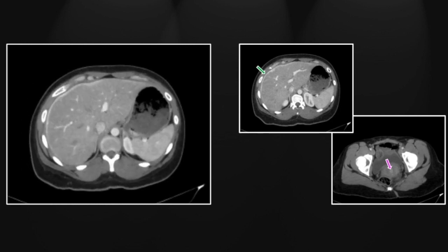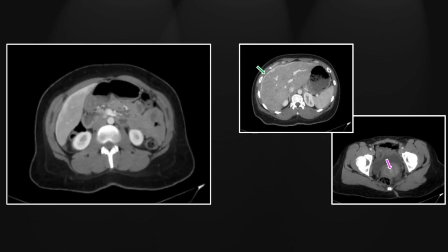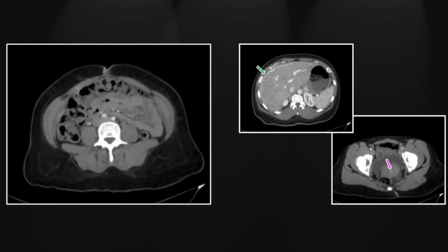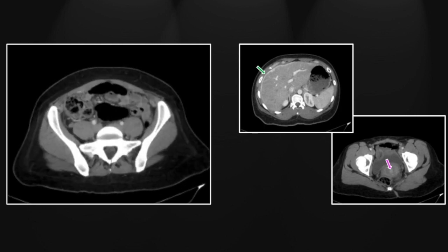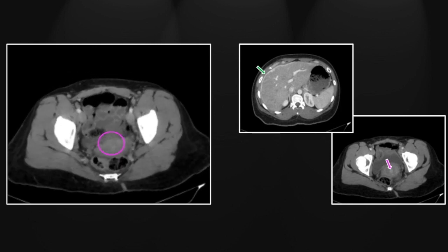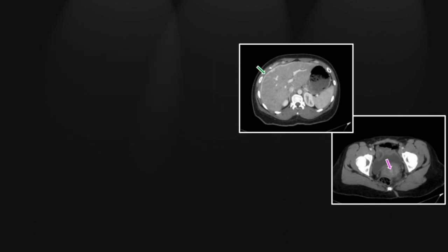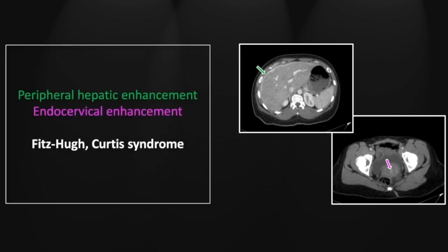Here you can appreciate that subcapsular parenchymal enhancement throughout the liver, and in the pelvis, cervical enhancement as well. That is a relatively unusual case of Fitzhugh-Curtis syndrome, with that subcapsular hepatic parenchymal enhancement tipping you to the diagnosis.